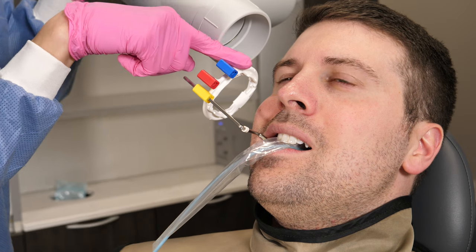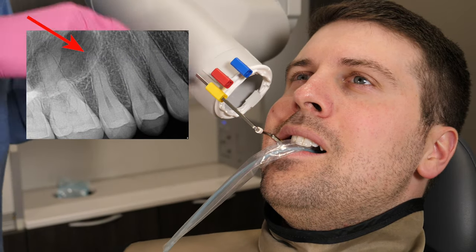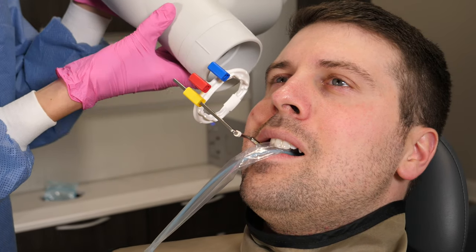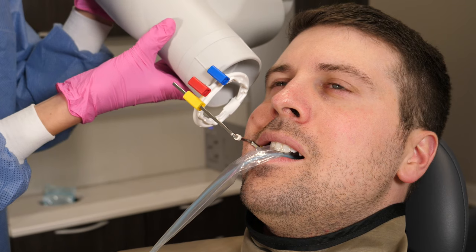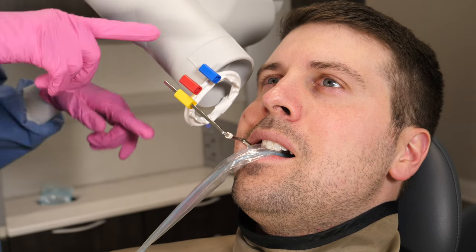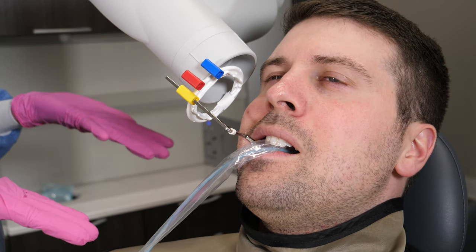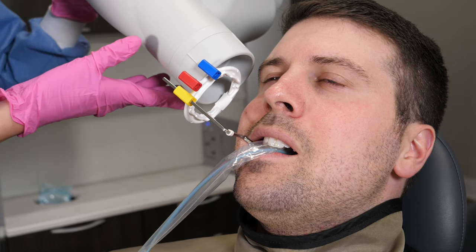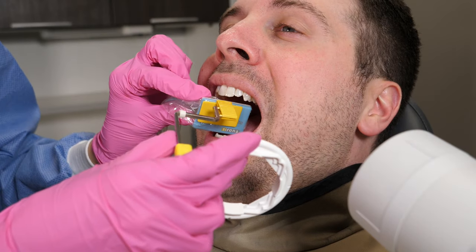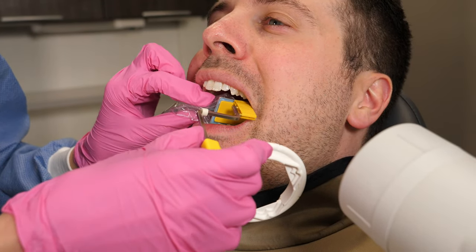For PAs, something that helps me a lot to not miss the apex of the root — you always want to make sure the root tip is visible on your images — is to angle the tube. Sometimes the angle looks super dramatic and weird, and I'm barely lining it up with the ring itself. Could you go too far and have your images foreshortened or elongated? Yes. So make sure you don't do that. Practice really does make perfect, and over time you will understand your x-ray unit to see how dramatic your angle can be and needs to be.